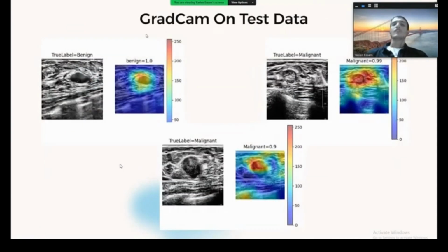This Grad-CAM uses explainable AI to enhance interpretability of our model, which indicates that our model's gradients are paying attention to the lesion of interest, which are the lesion tumors here in both benign and malignant. And we can see here that the photos have very complex lesions, and our model can behave very well on these complex lesions.